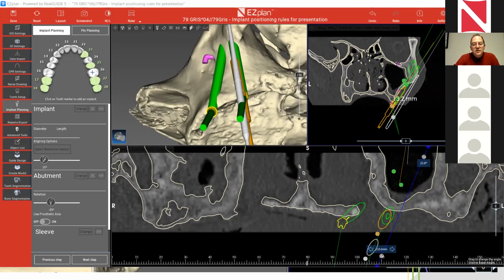Well, usually when zygomatic implants are placed in the bone correctly, we can get to torques up to 80 Newton centimeters. If you have a torque of around 30, 40, there is no problem for immediate loading. I've seldom seen zygomatic implants that we didn't load, as long as they're positioned correctly.